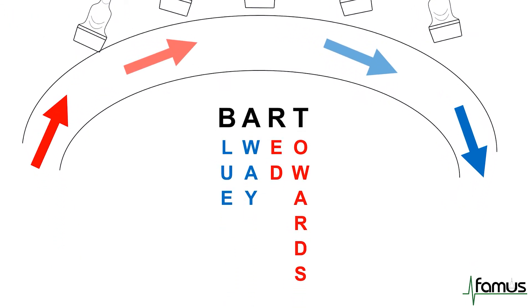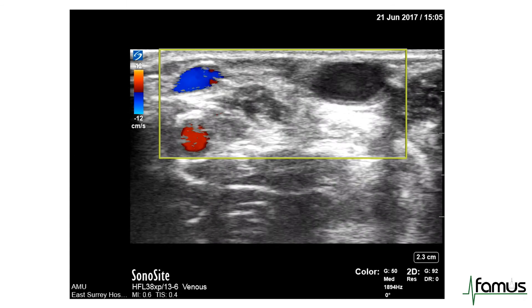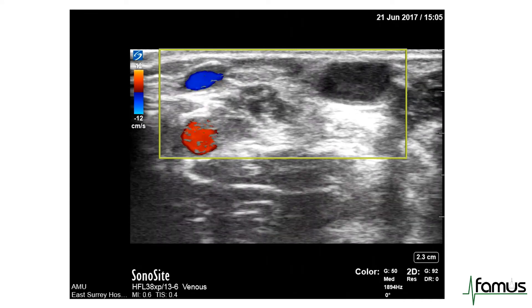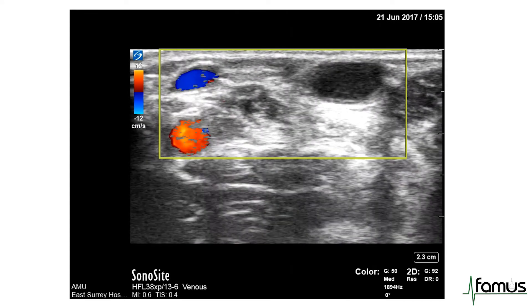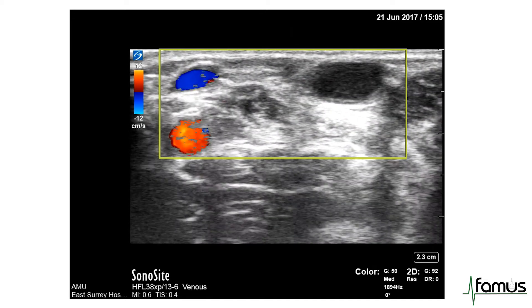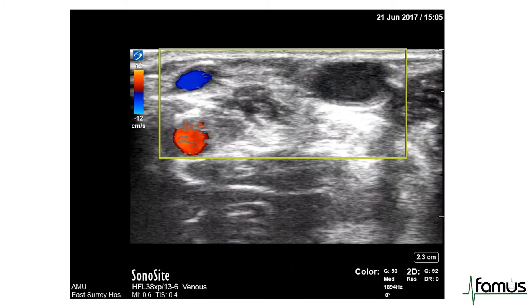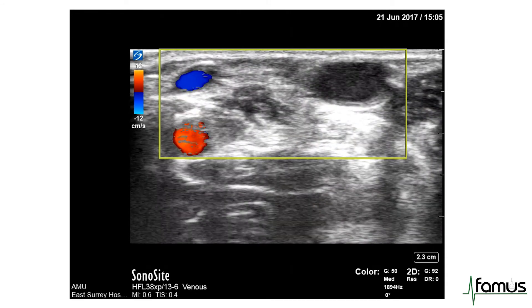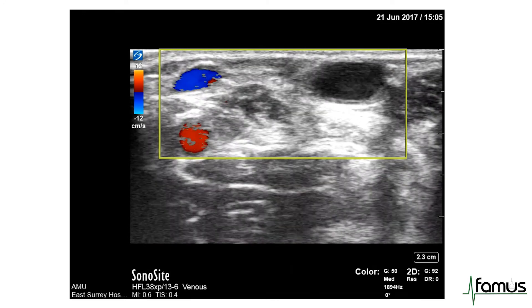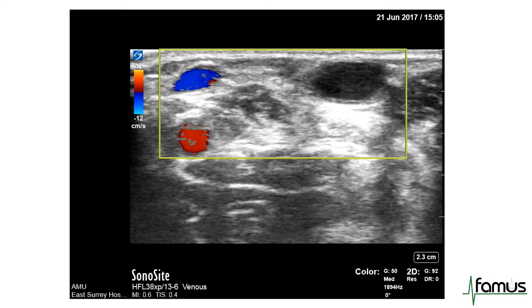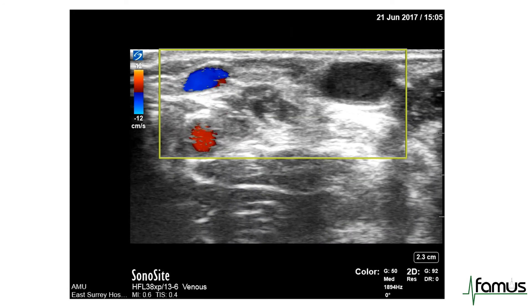The mnemonic to remember this is blue away, red towards, or BART. The example of that in real life is this image here, where you can see in the bottom left of the box you've got regular pulsatile red flow in the artery. In the vessel just above it you get transient low flow in a vein, and most of that flow is transmitted from the arterial pulse below it. Whereas in the vein in the top right of the box there's no Doppler color signal generated, indicating no significant flow. This partly depends on the settings of your machine and the sensitivity of the color Doppler, but generally you tend not to see flow in most veins on standard settings.